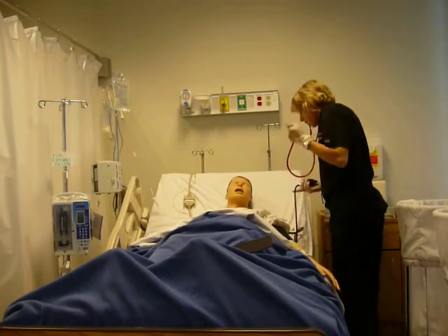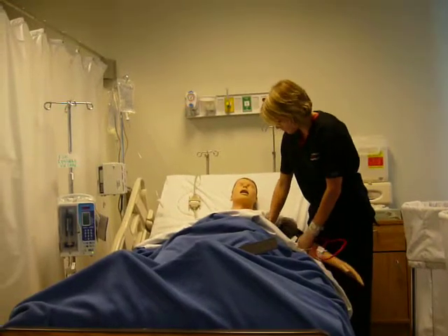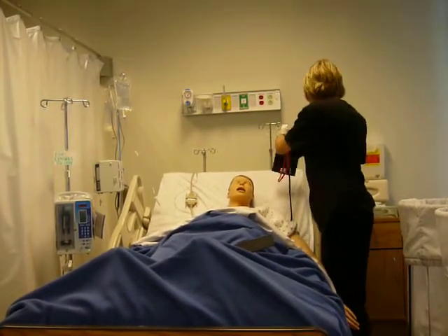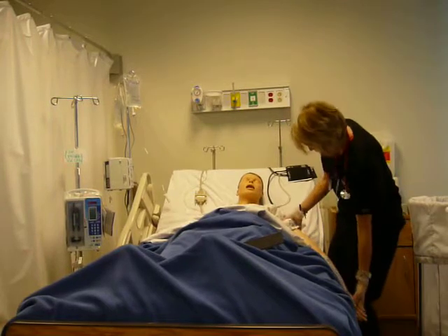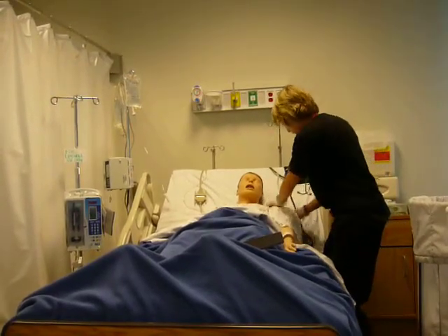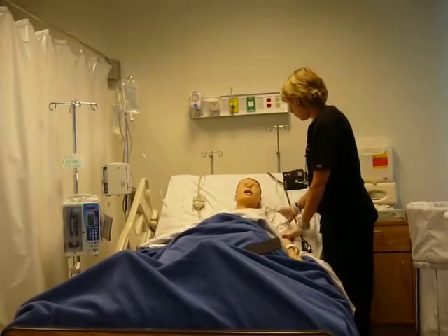So after you are done taking all of the patient's vital signs, you would make sure to chart this and have a complete record. Next, the anesthesiologist would come in to insert the device and would initiate the infusion device. After the insertion of the device, we would come in and check the label on the medication.